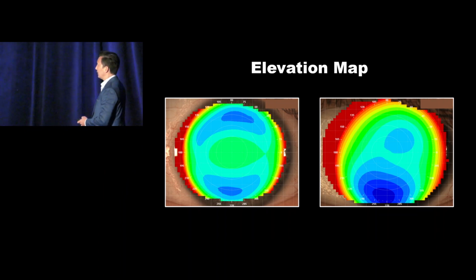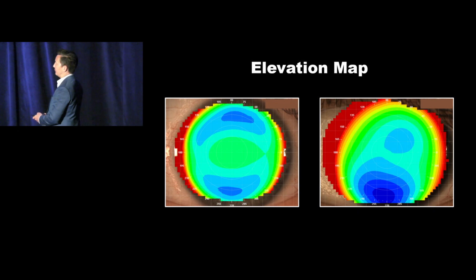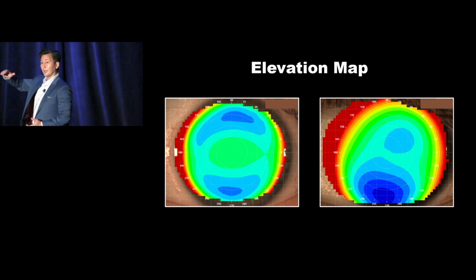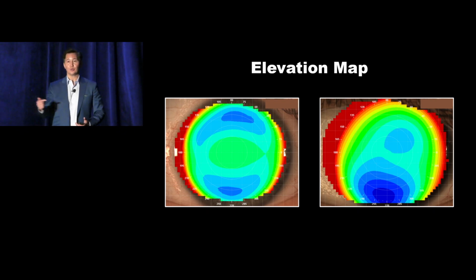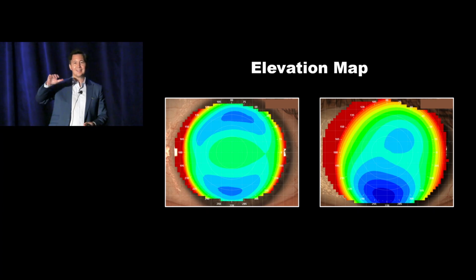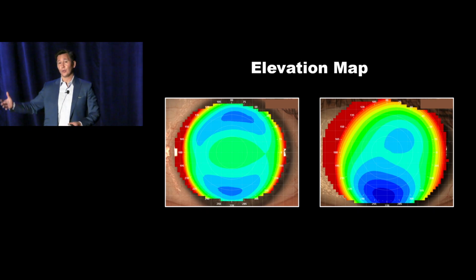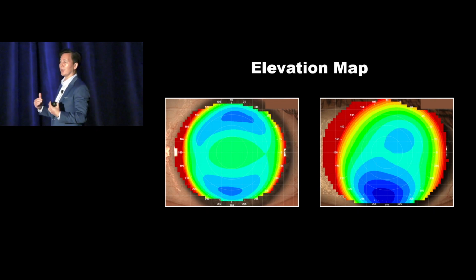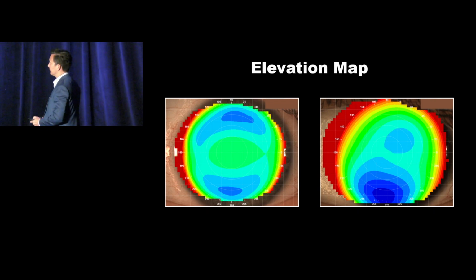So in our keratoconic patient, we can see that we might have landing across here, maybe arcuately all the way around, but right here is an abyss. That's the edge of the cliff. So that's your keratoconic eye curving radically and dropping in elevation. That's why you have all the pooling in those keratoconic patients, because the cornea is steep, but more importantly, the cornea is losing elevation. So red means the elevation is high. That's where you have landing. Blue is where the eye is depressed. That's where you have pooling.